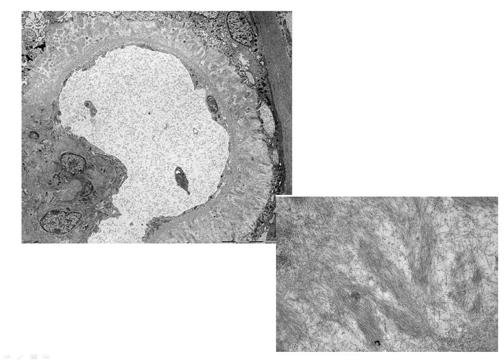And so you would see these little radiating projections on the silver stain, and if you were only looking at the silver stain, you might confuse it for a membranous pattern, but you would also have your Congo red on the same panel, and it would be an amyloid stain. And then if you did a higher mag, and this is something I should have put on Shannon's panel, you would see these filaments at higher mag, and you guys can definitely see the filaments. And then remember for boards, the diameter is 9 to 11 nanometers, not millimeters, nanometers, and that's the classic diameter you would talk about for boards.